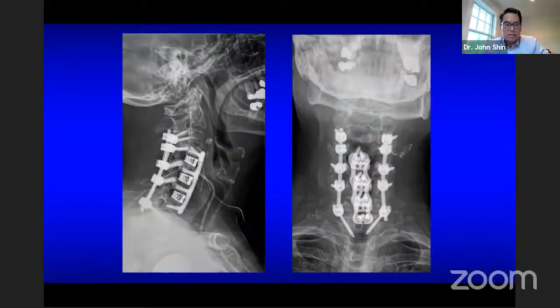For this patient, I did this through a combined anterior and posterior approach. I wanted to maximally decompress those C5 and C6 nerve roots. So it was a matter of trying to elevate, perform osteotomies, and get the C5 and C6 nerve roots completely decompressed through anterior osteotomies and posterior osteotomy. You can see here at C5 the correction, increased height. That C4 is now no longer subluxed over C5. This entire wedge of bone is gone, so the uncinate processes have been taken down. Posteriorly, the posterior facets have also been resected, drilled out, with cervical thoracic instrumentation, as you can see here, okay?